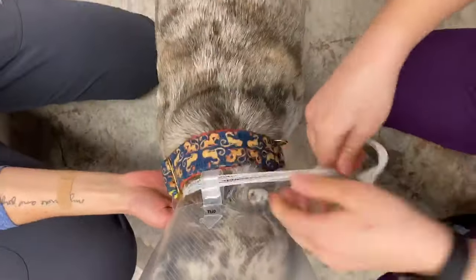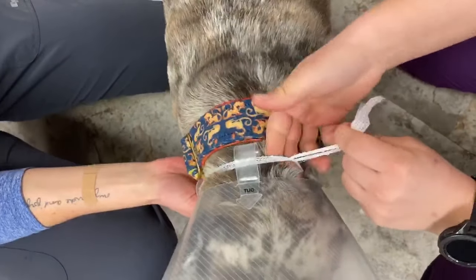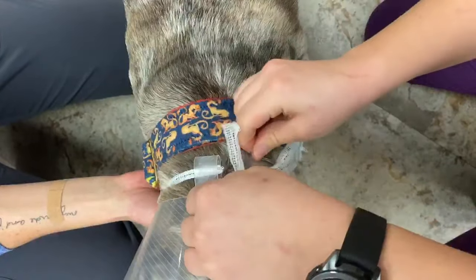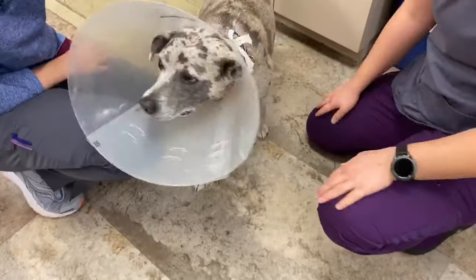With your gauze, you want to tie it just tight enough where you can fit about two or three fingers under it and it doesn't move around. So I'm just going to bunny knot it. And then we're good. It doesn't come off, it's nice and snug. And that's it. Thank you.